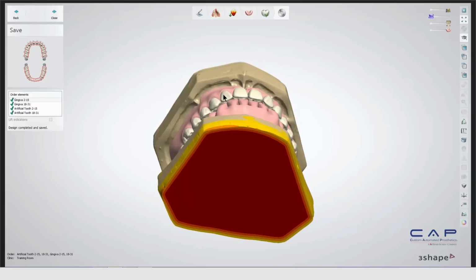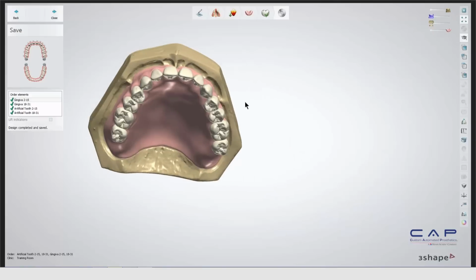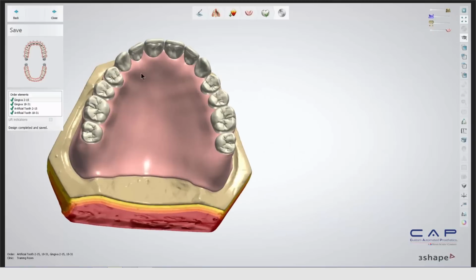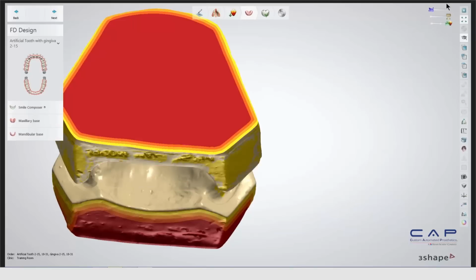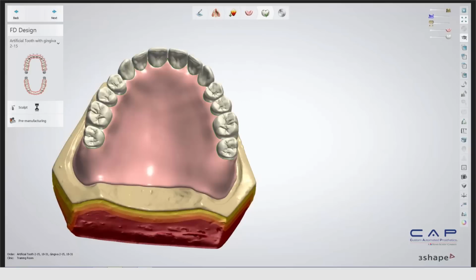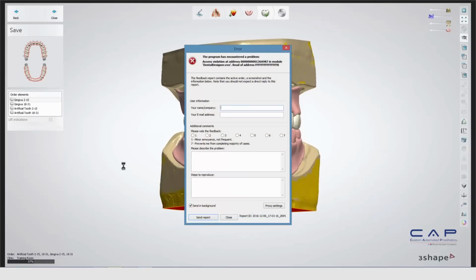So say if we wanted to do the upper here, let's turn off the lower here. If you wanted to do the upper and increase that rugae so they don't have so much of a lisp, you can go back in the design stage, where we're sculpting. On the sculpting stage, if you wanted to add to that instance there, it's giving us an error because we've gone back and forth without it loading.